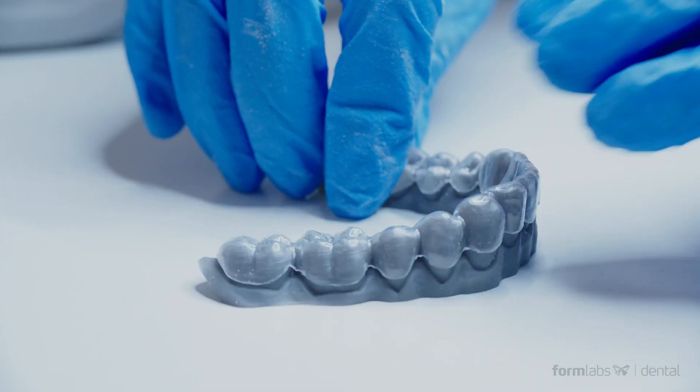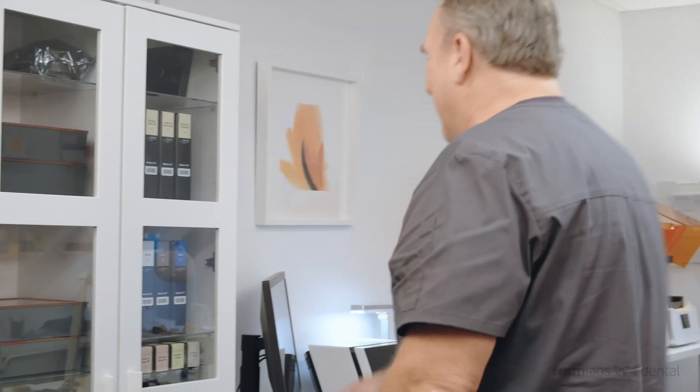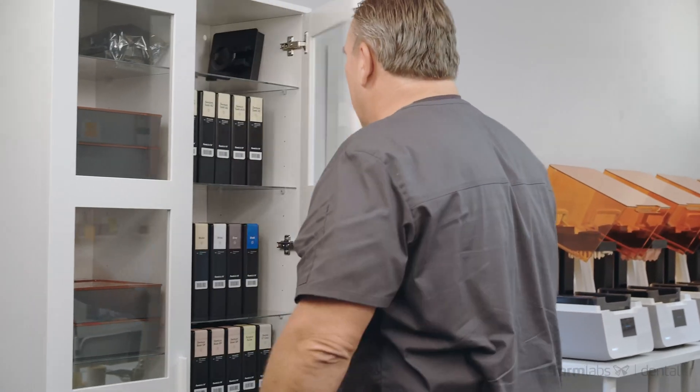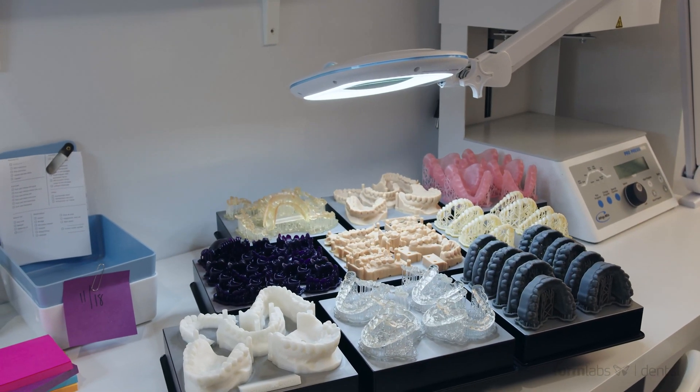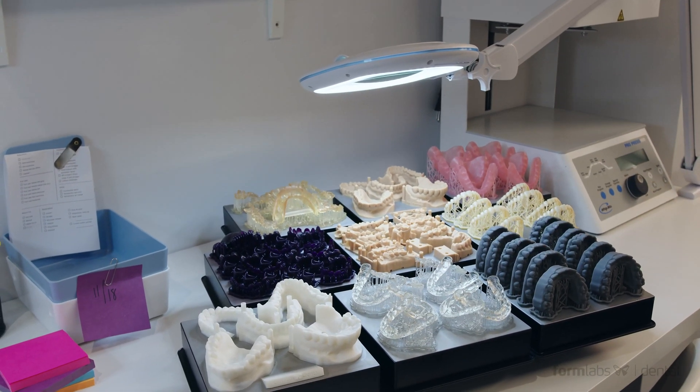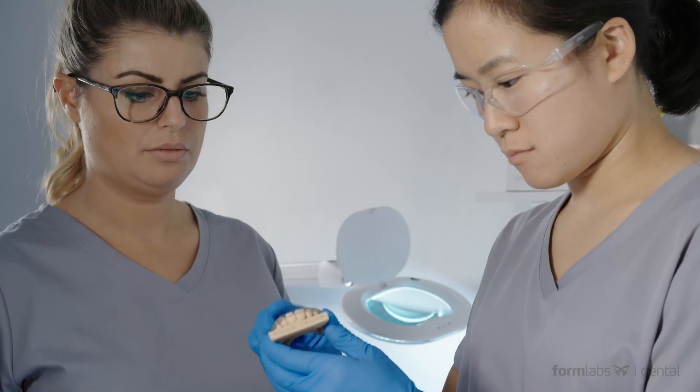An always-expanding library of materials, including biocompatible and dental-optimized resins, provide ortho practices with unparalleled flexibility.